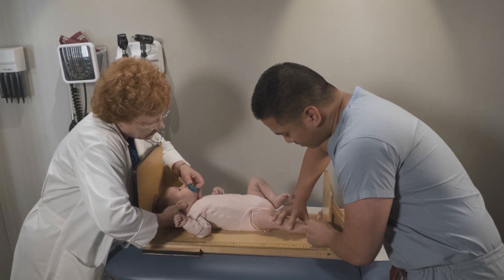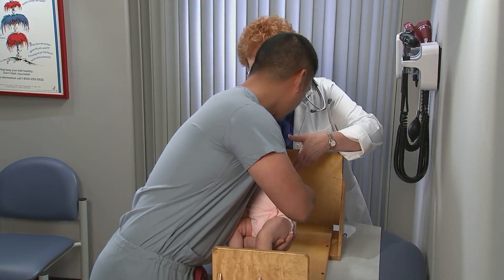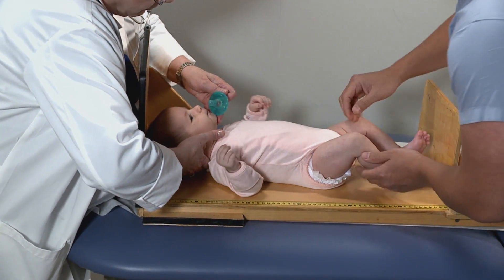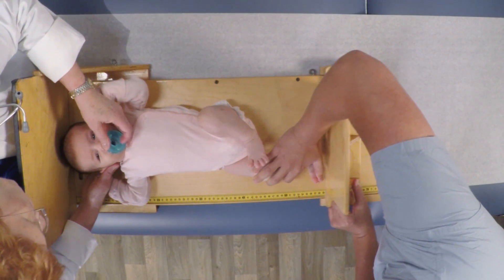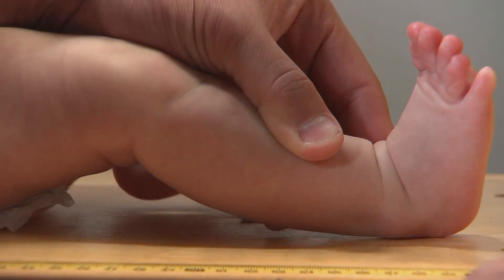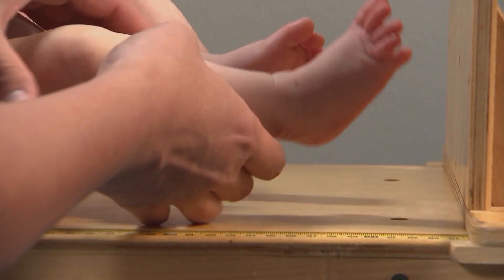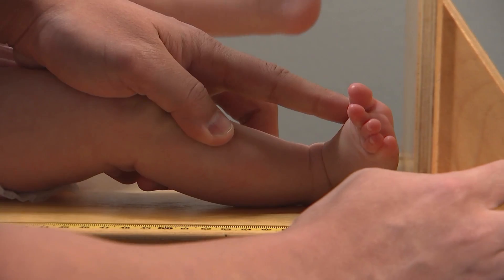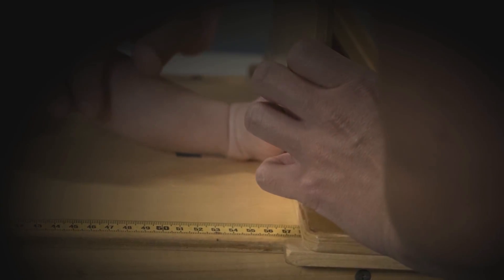Measuring length ideally should be completed by two healthcare providers. To measure length, lay the infant face up on an infantometer. The first healthcare provider correctly positions the newborn's head against the head plate and gently holds the head in this position. The second healthcare provider gently presses the infant's knees to straighten the legs, then presses the bottom of the foot onto the foot plate so that there is no gap between the foot and the foot plate. Record the length of the infant by reading the measurement on the infantometer.